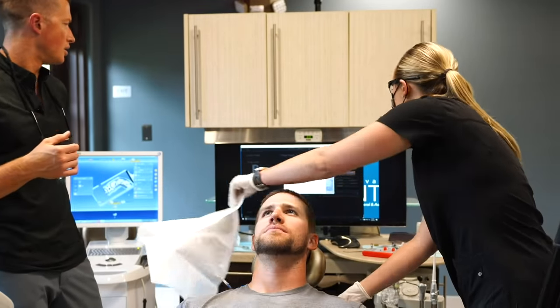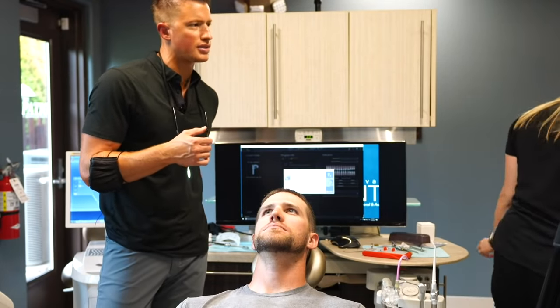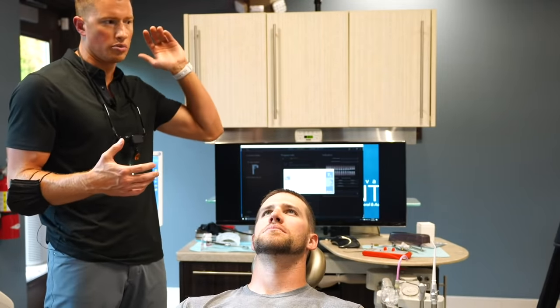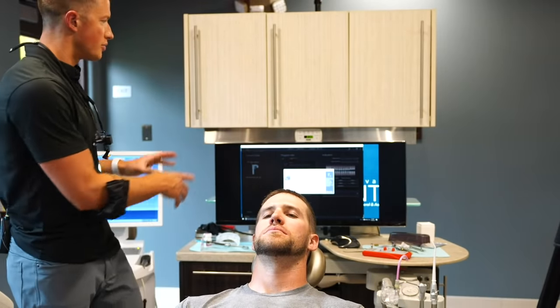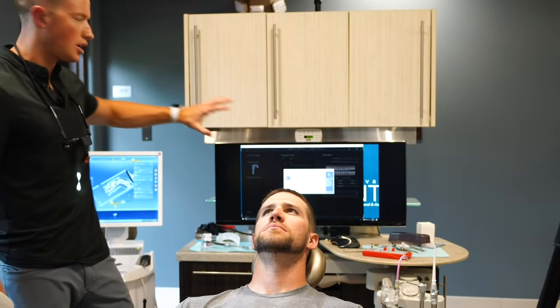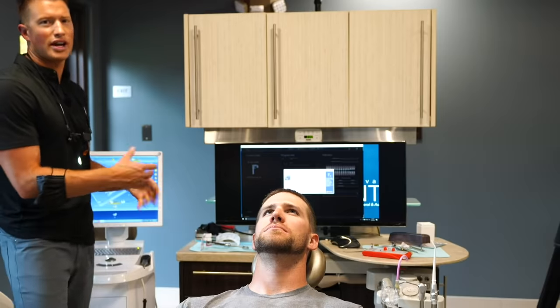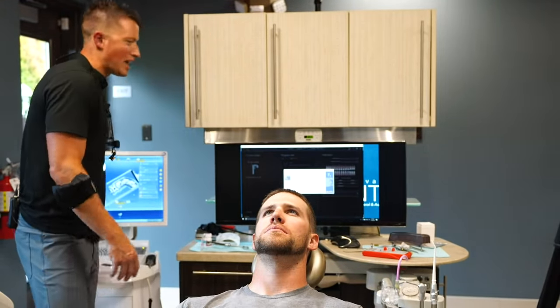I have done a handful of freehand, really as a learning process when I had more than sufficient bone. But once you've done them guided, and by the way, our team is capable of doing almost 90% of that process. Obviously planning it in the software, placing that implant where I want it to go in software. But as far as imaging and scanning, all of that stuff, we have an awesome team of auxiliary members that can make that all work out.